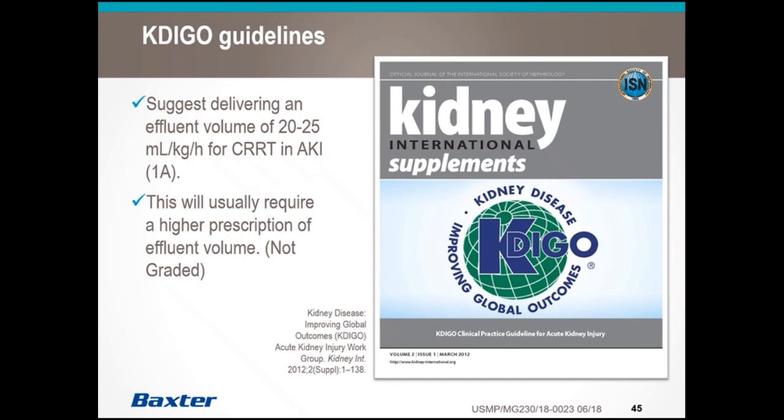So basically your effluent dose consists of your dialysate, replacement, and any net fluid the doctor's ordered for the patient. Things like tube feedings, TPN, pressors, all the extra additional fluid that he or she wants to pull off the patient. And so the suggestion is to deliver an effluent volume of 20 to 25 mLs per kilo per hour. You will see under that it says this will usually require a higher prescription of effluent volume. So what is meant by that is the recommendation from the guidelines is to deliver 20 to 25 mLs per kilo per hour.